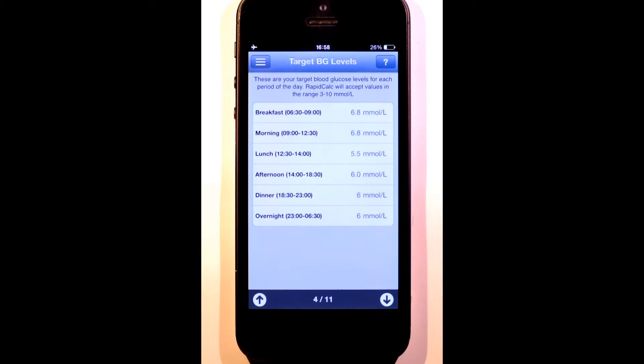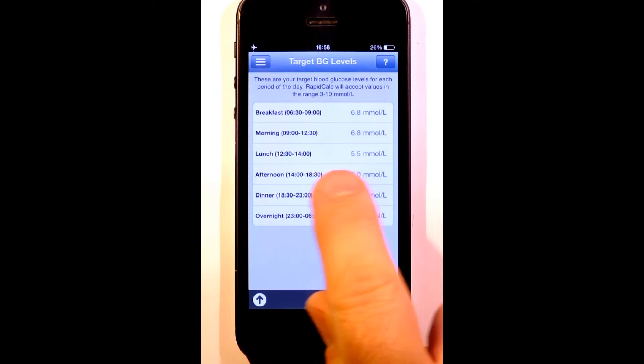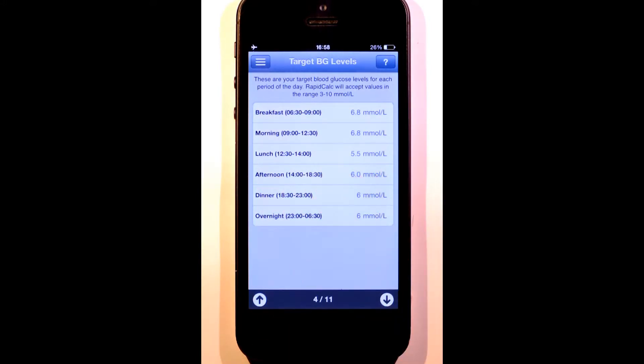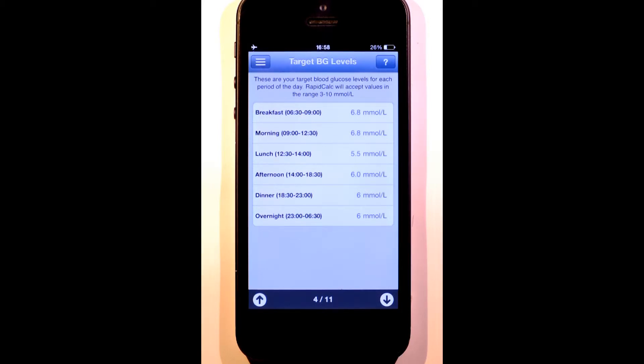For me though, my lunch target is 5.5 mmol per liter, which means that during the lunch period, RapidCalc will calculate the dose needed to get me to this target based on my current blood glucose reading and my planned carb intake.